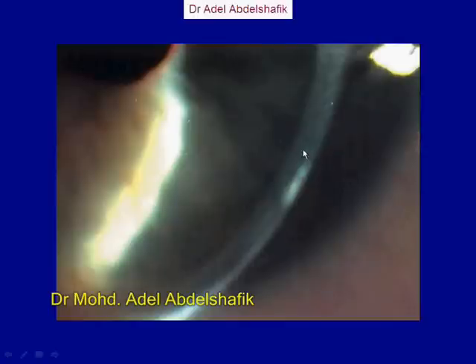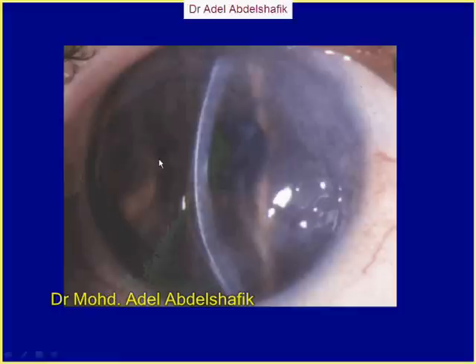Here, this is the section in the cornea. We don't see these two lines because this image is not that focused, but clinically you can do it. Back here we get the endothelium, anterior chamber, iris. What do you see in this image? I would say this area as a whole looks a little bit hazy.